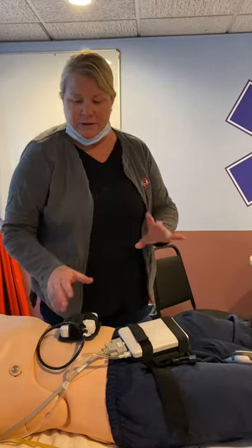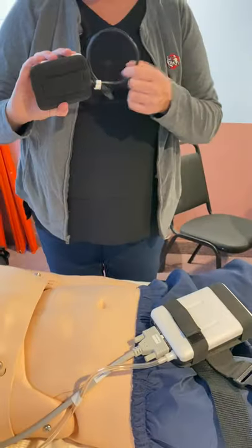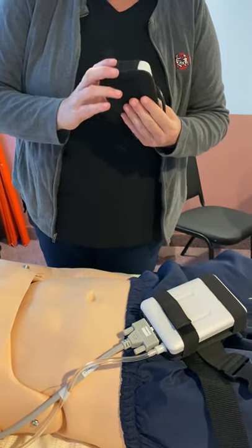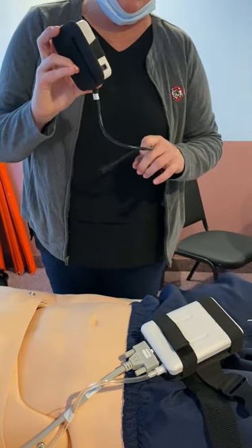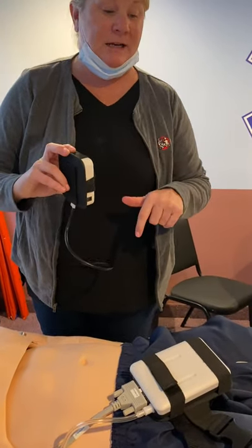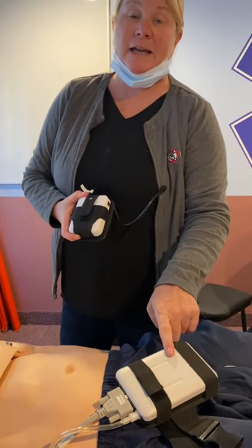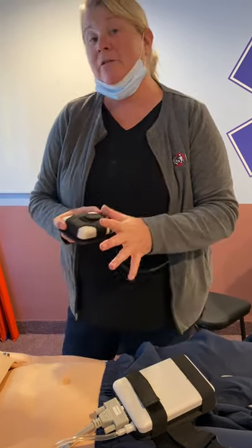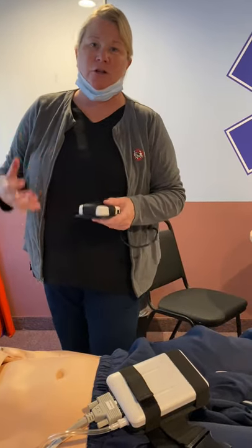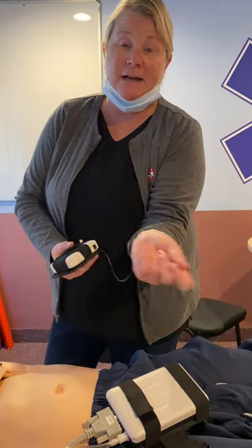We're going to start with this connection here, which is the link box. This is the external battery pack. This battery will take a charge and run for four hours. It takes about one hour to fully charge. The AC power adapter that came with the mannequin — you got two. One that runs the battery will also run the link box. In the event that the battery isn't working or it's not charged and you need to run a session, you can use that AC power for the link box to direct connect into the wall.